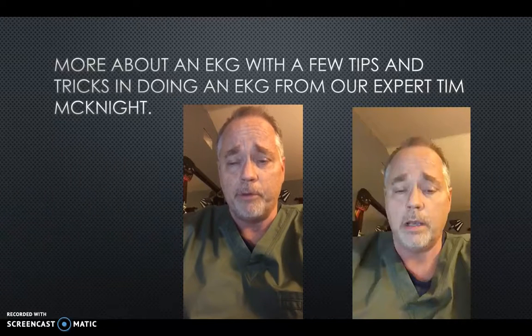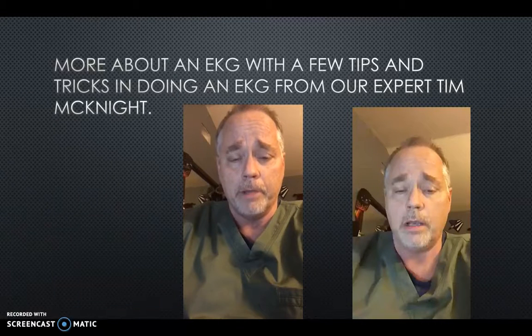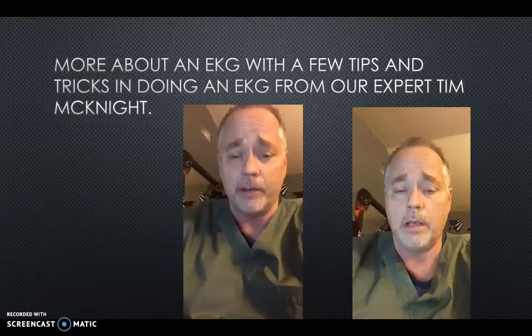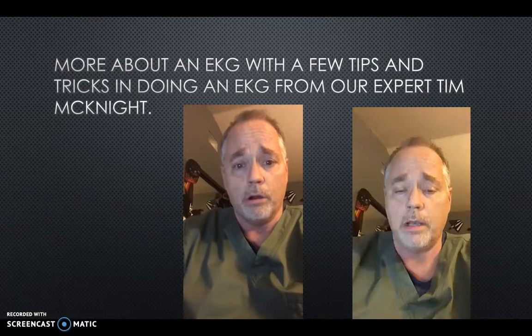A few things about an EKG: it really is a baseline examination, establishing a baseline so we can look for changes in the future to help diagnose. It's one of the diagnostic tools for really any kind of cardiac related illness.